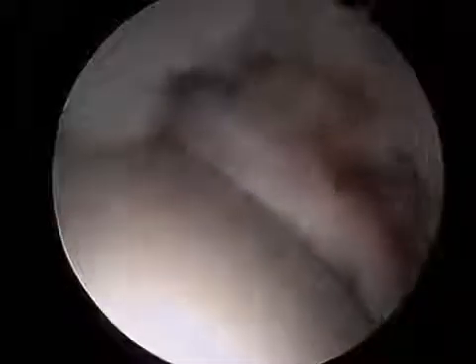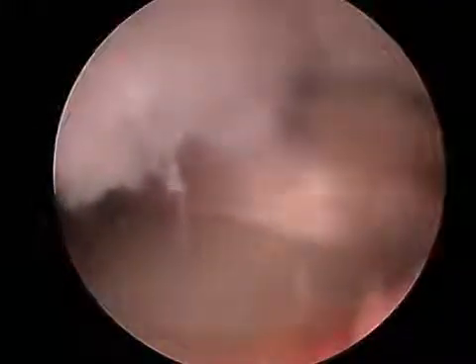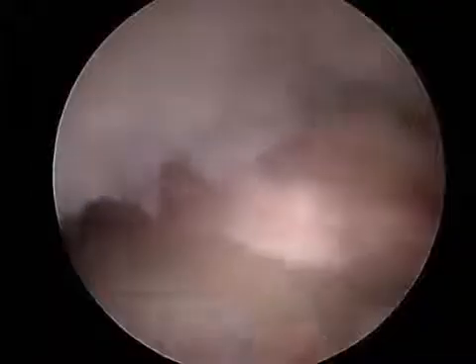This is a patient in whom I've already performed a labral repair. You can see the blue sutures in the labrum at the top of the screen. At the bottom of the screen is the femoral head engaging into the acetabulum. There's a bump on the head which displaces the labrum as the hip is moved through range of motion while I'm looking at it with the camera.